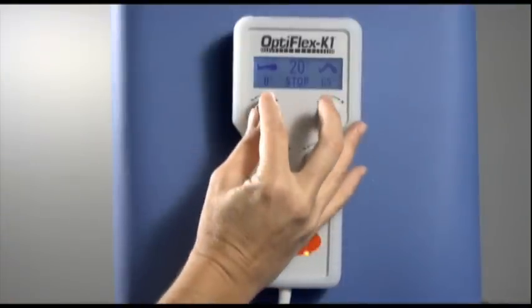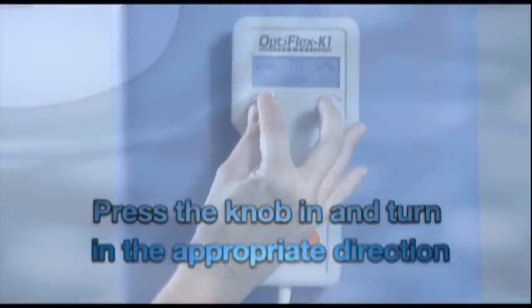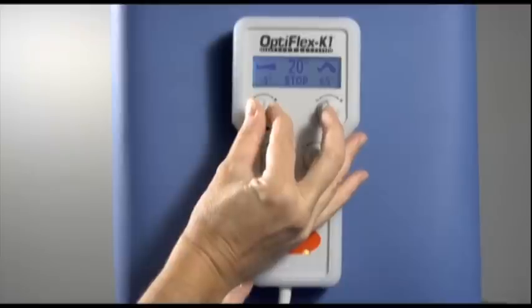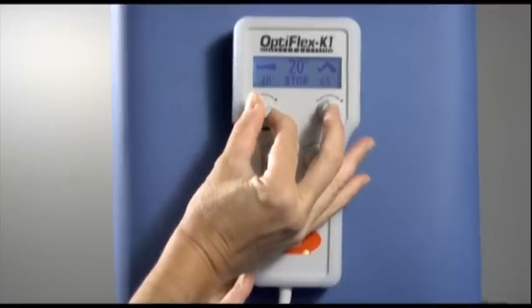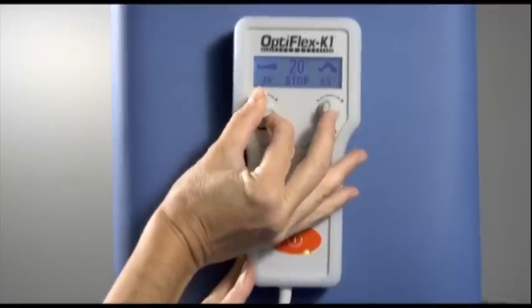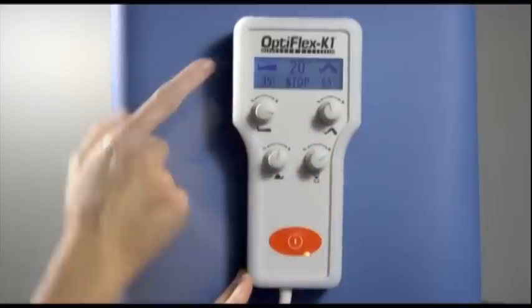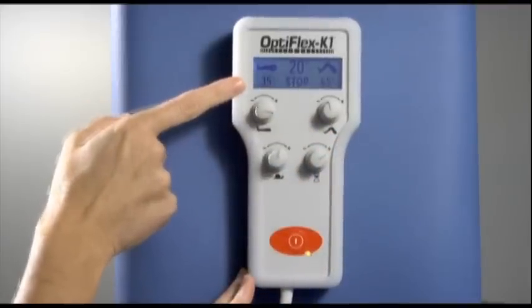To adjust the extension limit to your prescribed or desired limits, use the extension knob symbolized by the picture of a straight leg. Push the extension knob in and turn in the appropriate direction. Note on the hand control that the extension setting is on the left side of the display.